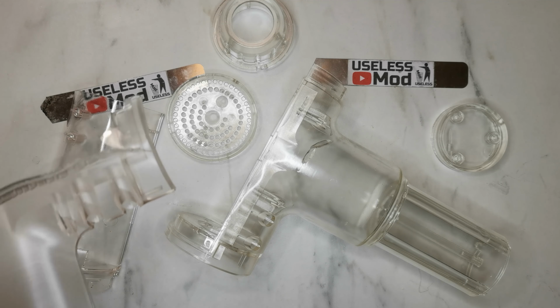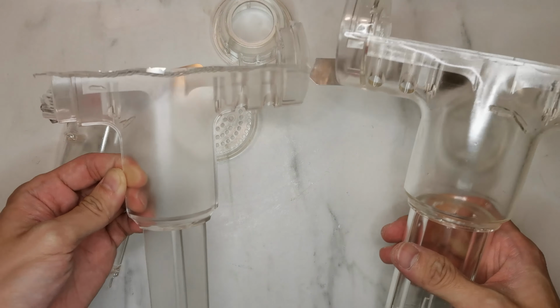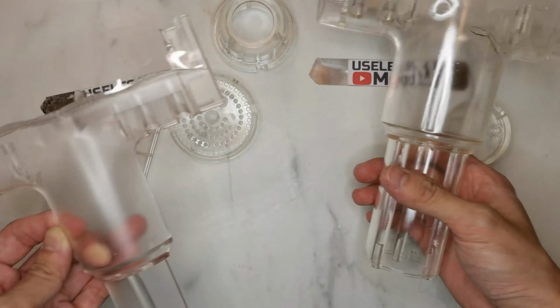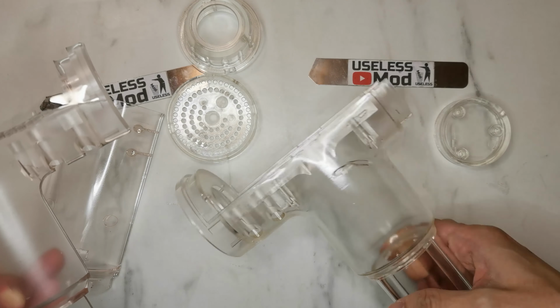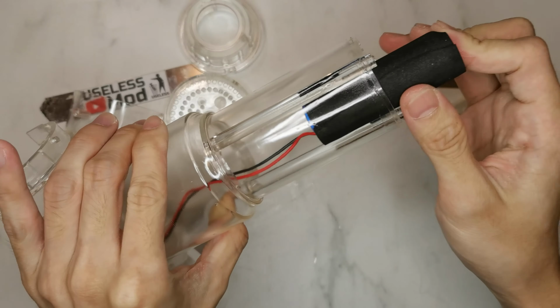I added top coat to make the case look more transparent. As you can see, this one is the original and this one is after adding the top coat. Start putting things back together.